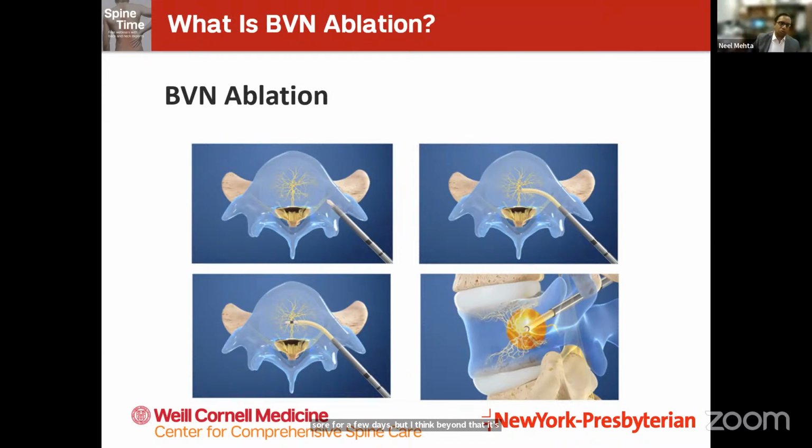And when would you expect to start to see the benefit after the ablation? Maybe Dr. Salama, you want to answer that, or whoever wants to take it. I think it's pretty quick. Some patients have a temporary increase in pain just from having a procedure done on their back. However, often patients will start seeing results within a few weeks, and certainly by 3 months, once the post-procedure discomfort goes away.